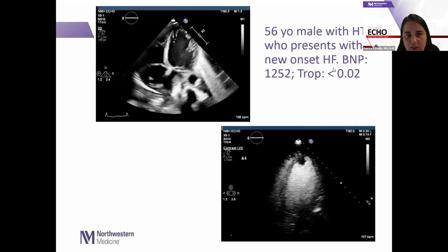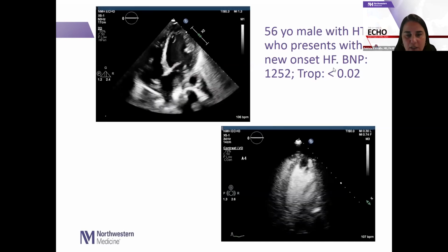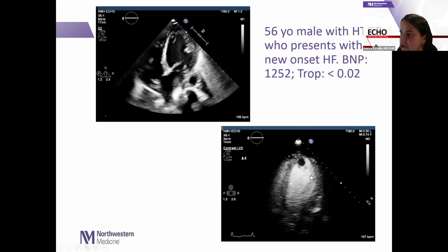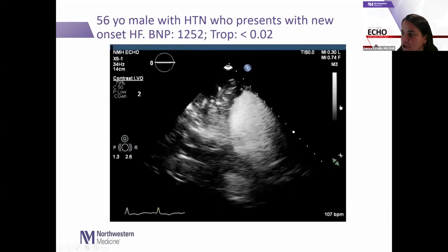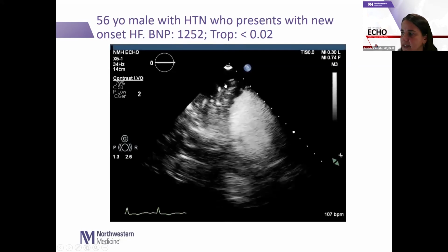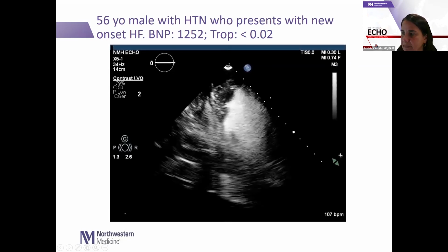So in this patient, back to this patient with concern for the increased trabeculation, you see now that this is a papillary muscle and that there is good opacification of the left ventricle, except for this echo-free zone, which is consistent with LV thrombus. The apical 2 chamber view is still technically difficult, but you see that it is less rounded. And again, you see that there is thrombus in the apical inferior segment.